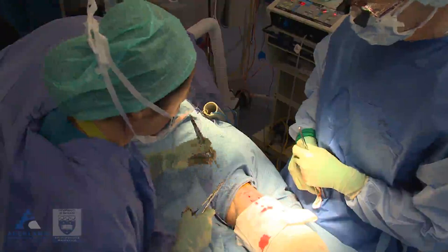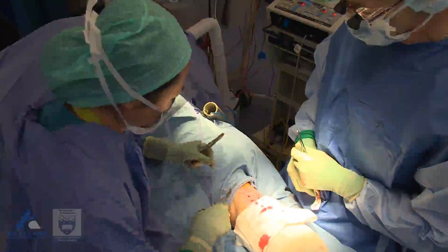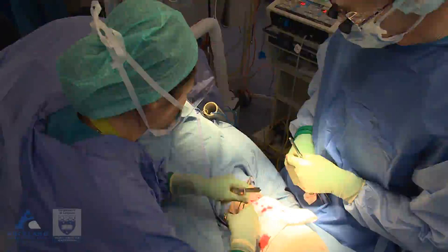Pull that through. And then two throws. That's right. Pull that through. That's good, that's perfect. Well done. You've thrown that so that the knot is going down in the line of the wound. Very good.